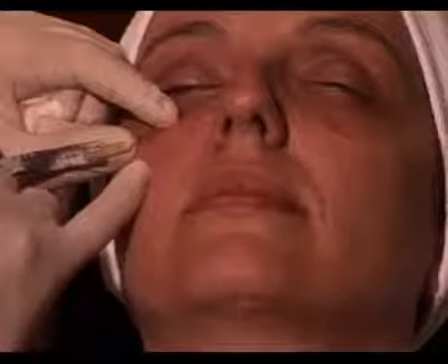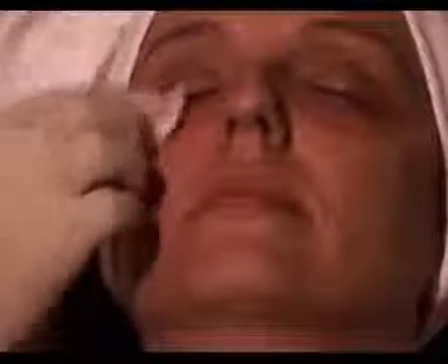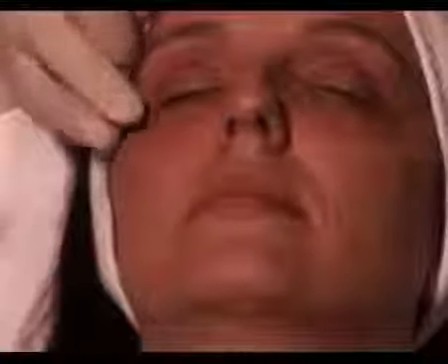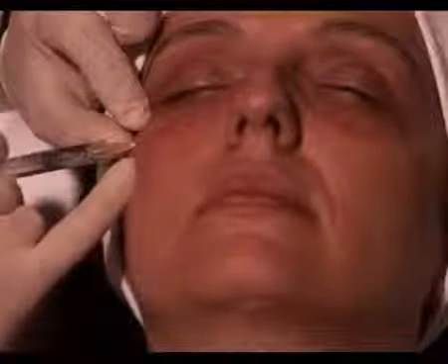And then the final injection, also to the tear trough, stretch. And then you're going to go in, touch a little bit of the bone, and then you're going to be injecting your bolus over there. Now, if she has a little bit in the palpebromalar groove, you also need to inject it, and I advise you to do that at the same time while you're doing this. And that's what I'm going to do. So the palpebromalar groove exists on the lateral side, and you can definitely inject a little bit more. Now, I've injected 0.5, so that's basically as maximum as you want to go into the tear troughs. But you can inject a little bit more into the lateral aspect.